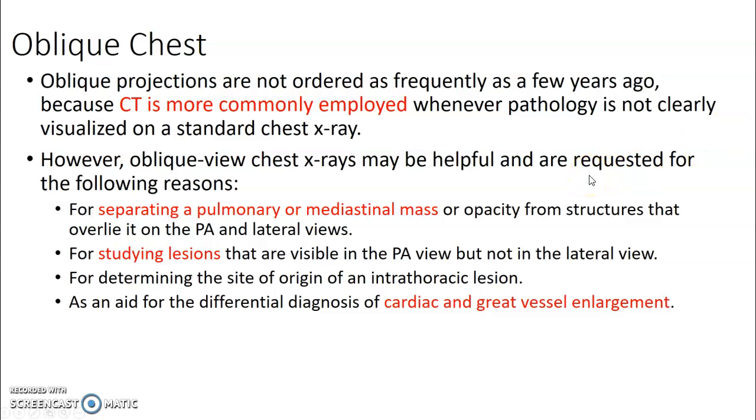Oblique chest. I have never done an oblique chest as a technologist, but it's in your textbook, and so I would like to just go over it. You won't see it routinely. It may be something that's requested at an offsite or randomly by a doctor. Most oblique projections have been taken over with CT. A CT of the chest is a more in-depth procedure than an oblique chest.